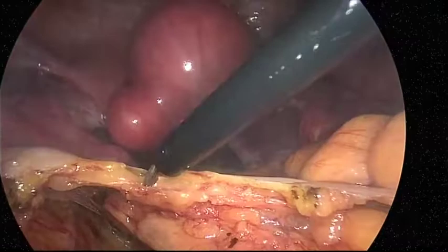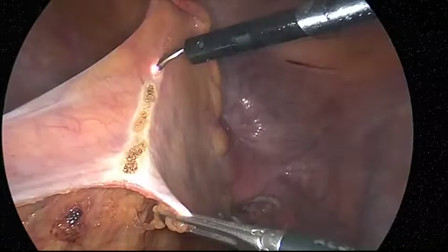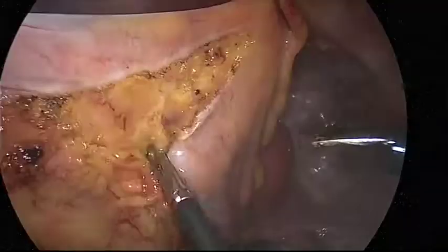The mesocolon is then dissected, exposing the colonic wall just on the cut line of the distal colon.